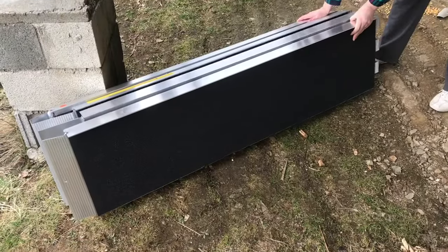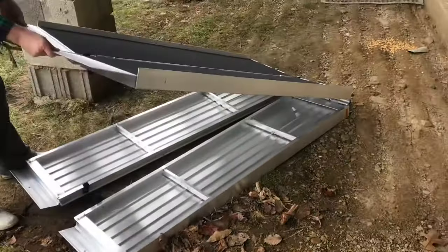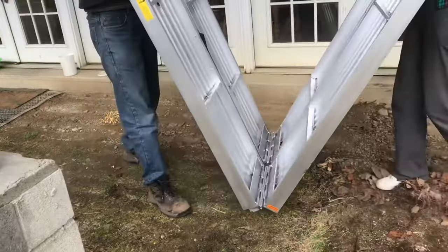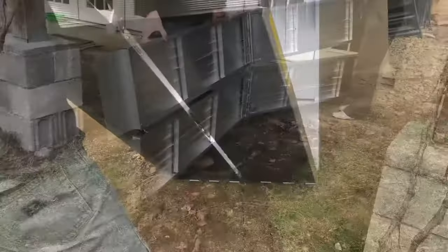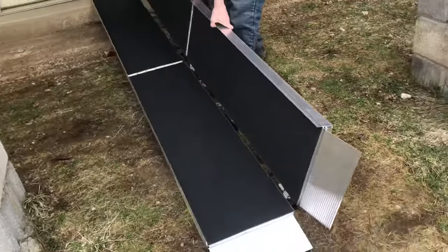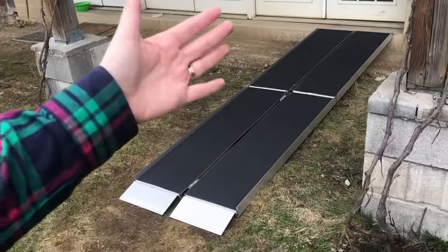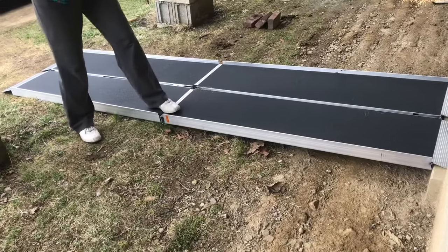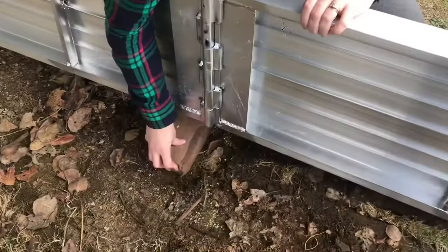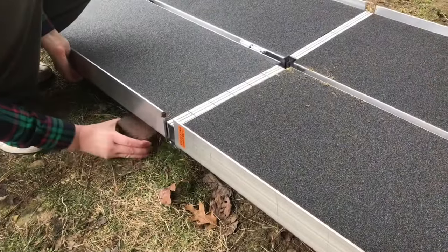We'll unfold it one way, then unfold it the other way. Now it's in place in front of the door. Because this ramp is so long, we're going to need to stabilize it from underneath — see how it flexes in the middle? So we'll put a brick here in the middle, fold it down, and a brick on each side.